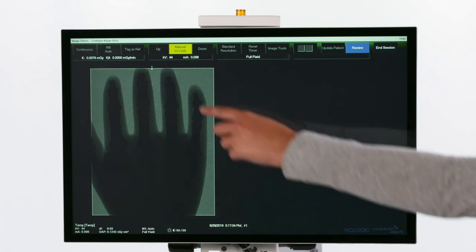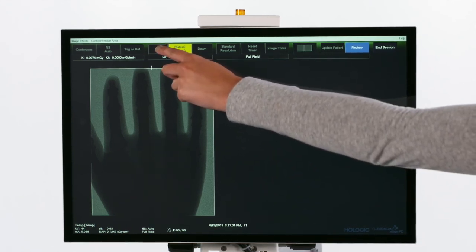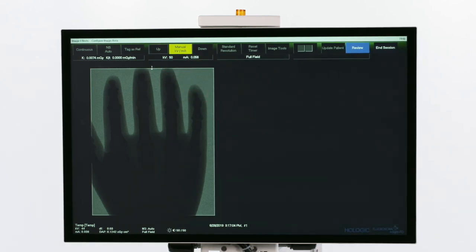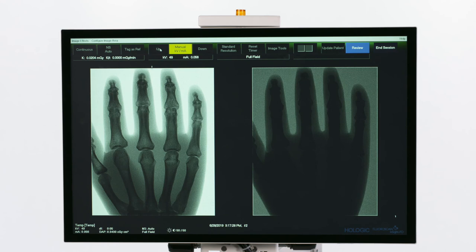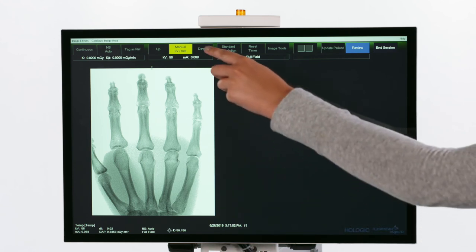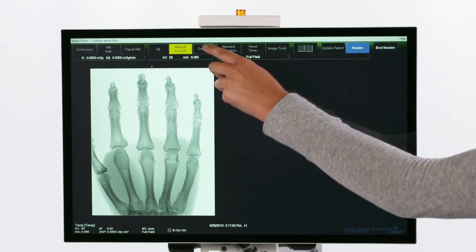If the image is too dark, increase the kilovolts and take a new image. If it is too light, decrease the kilovolts and take a new image.